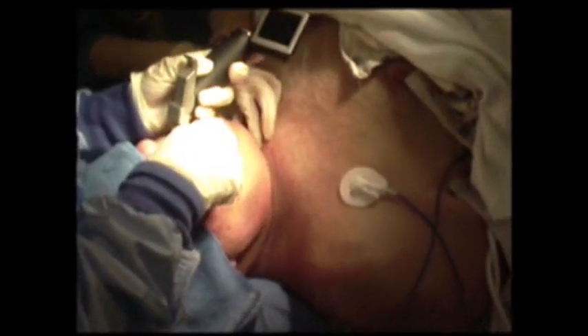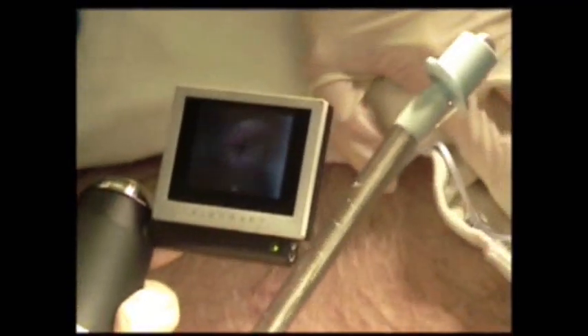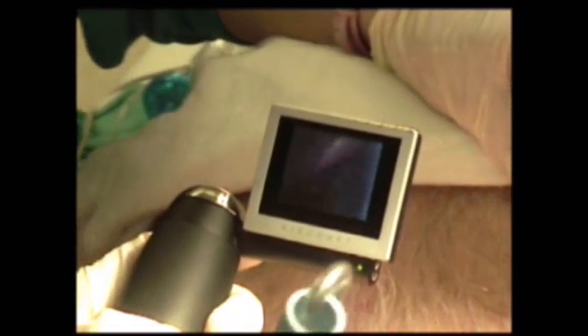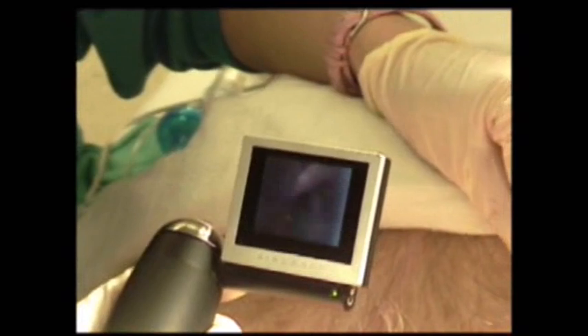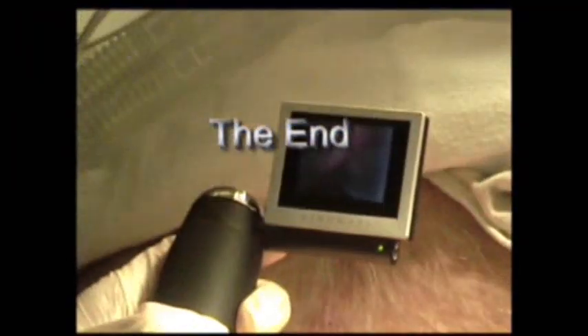There we go — got the cords. Great picture. So getting a good view is not the challenge so much as passing the endotracheal tube. He's breathing a little bit. I'm in, it's just — there we go, it went in. It's done.